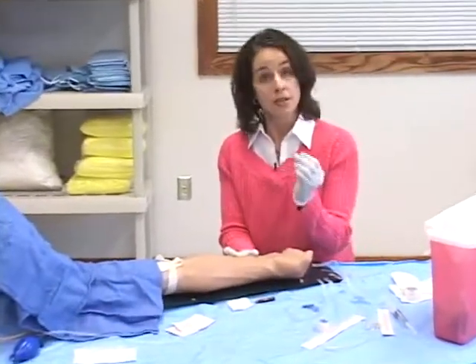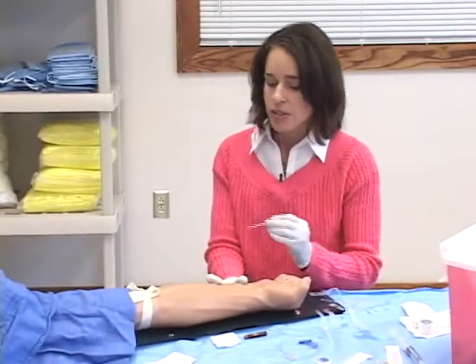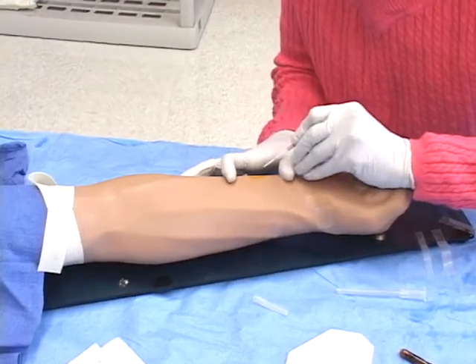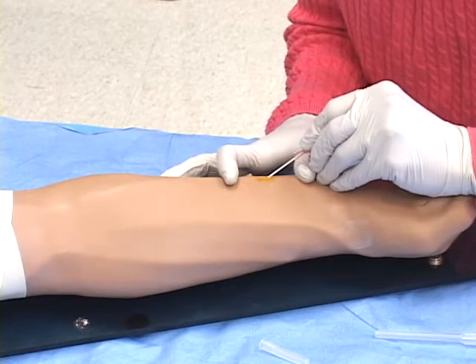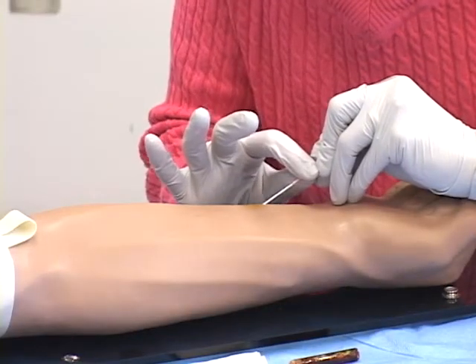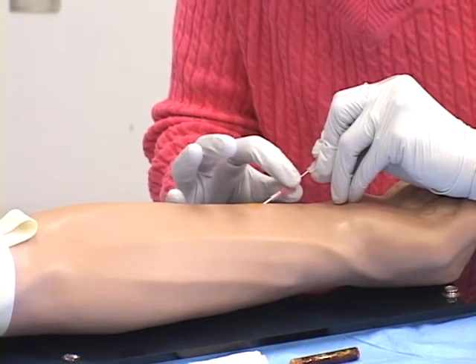And when you enter the patient's vein, you want to enter at a 30 to 45 degree angle, and then, of course, depending upon the site, the angle may be a little bit different. So you're going to begin at a 30 to 45 degree angle, with gentle traction with your non-dominant hand, and you're going to feel the needle go through the vein. At this point, it's important to progress the catheter, but not the needle.